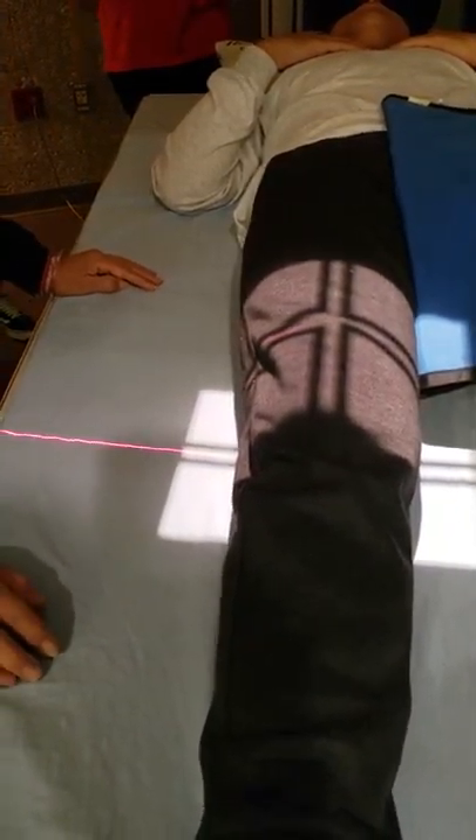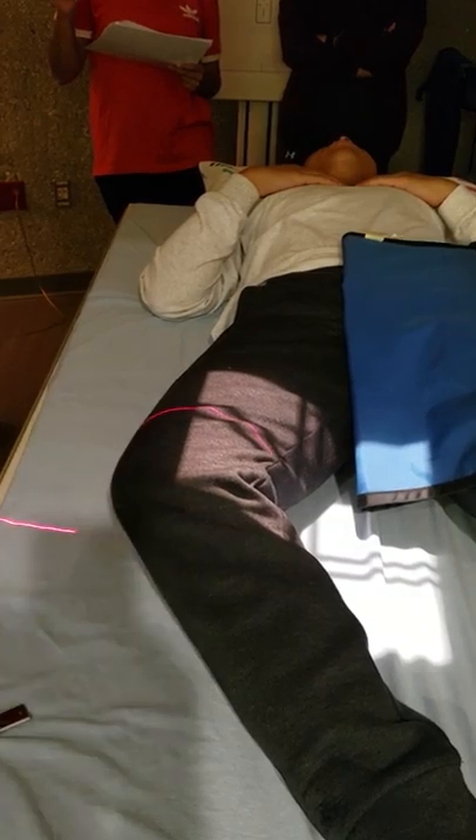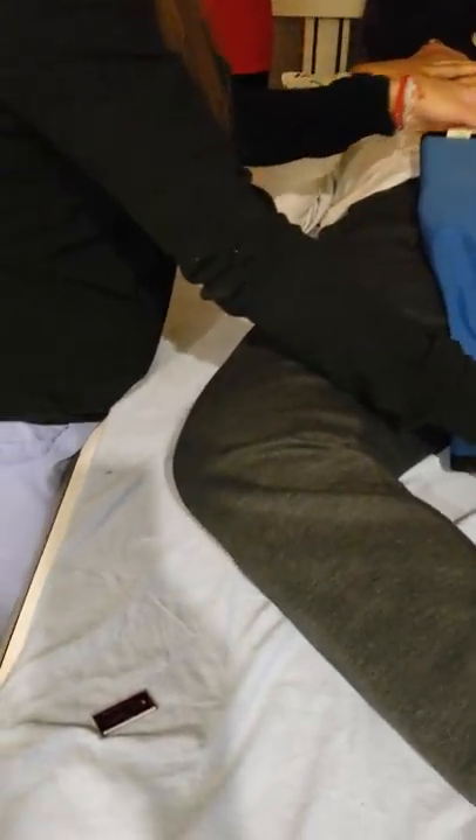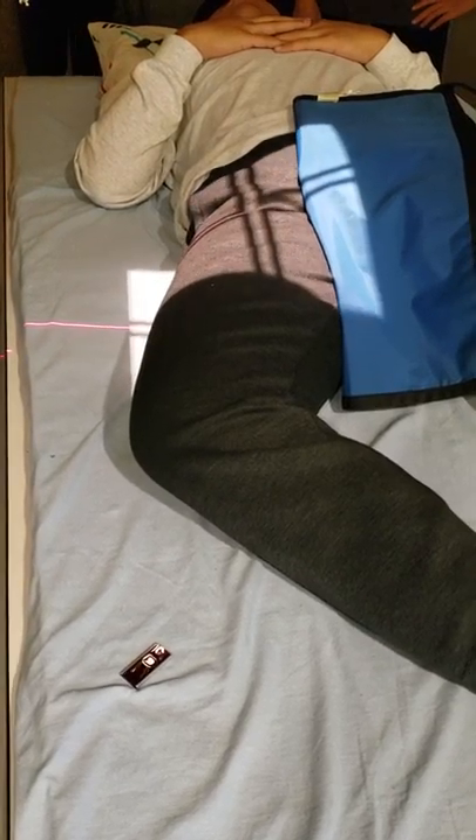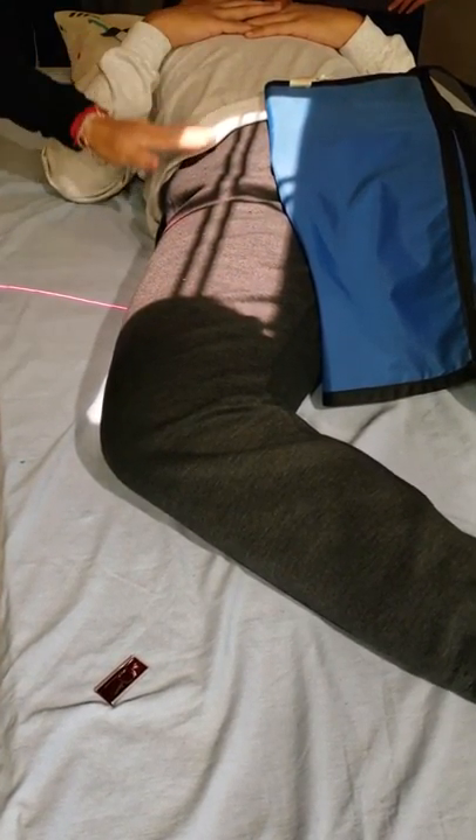Now we're going to do the side view — the lateral. If the patient is healthy, we're just going to bend the knee slightly. You're going to use a sponge here for comfort, placing it on the side, just slightly. I'm going to place it behind the leg and have the leg completely sideways, touching the board — see how there's no space? Then go back up, find the ASIS, and get the 14 by 17 lengthwise. That's for your AP. This will be your lateral.